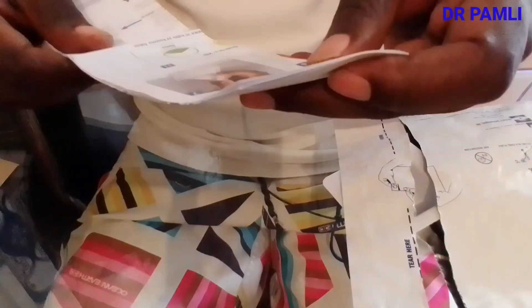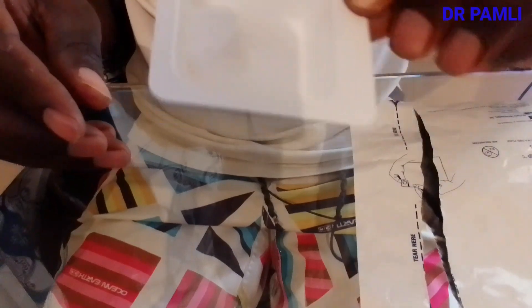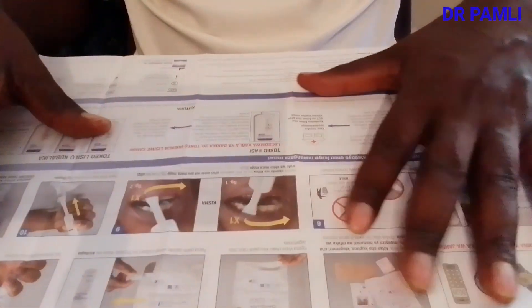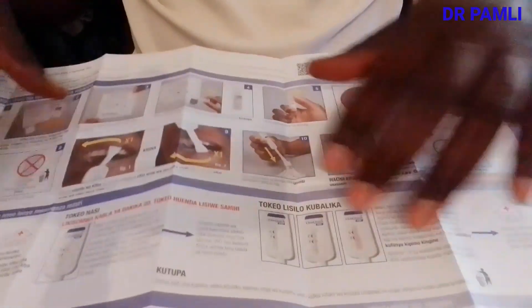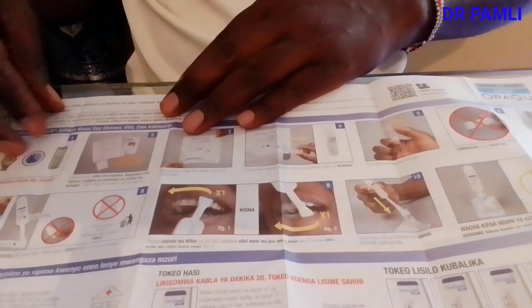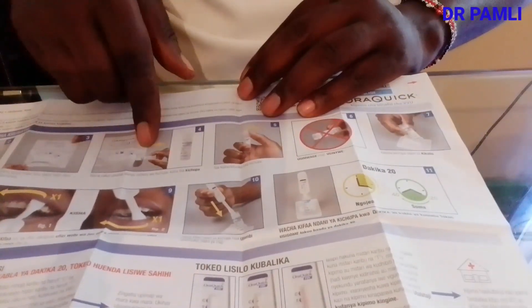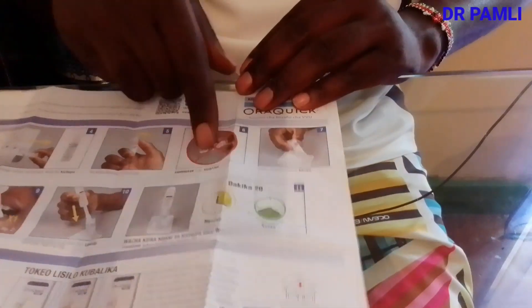There is also an instruction sheet — like a procedure manual — telling you what to do from step one to step eleven. There is also a stand used to hold the tube. Check that the stand is stable before moving forward. The test procedure manual covers everything you need to do for testing yourself. A timer is very important — you must have a watch.